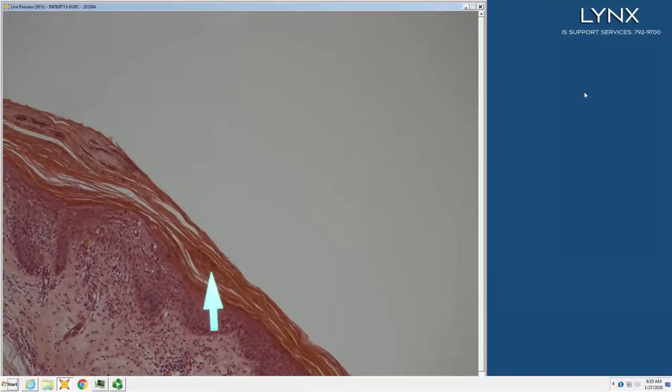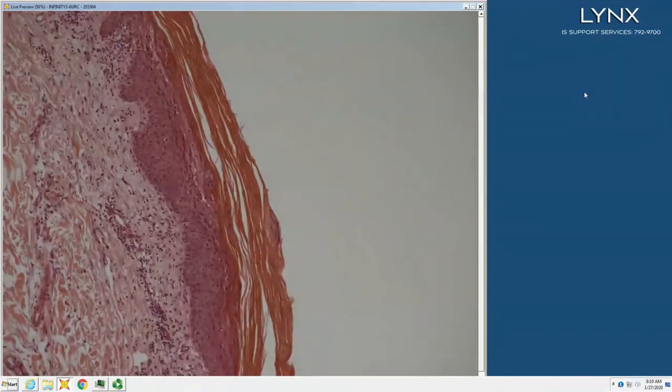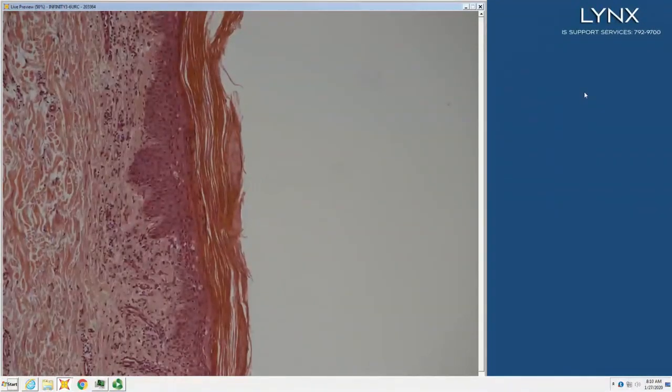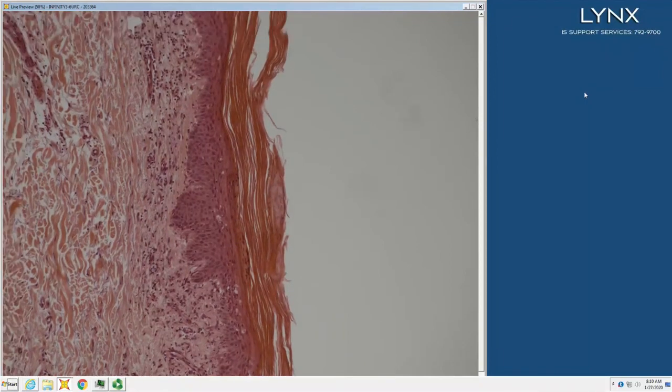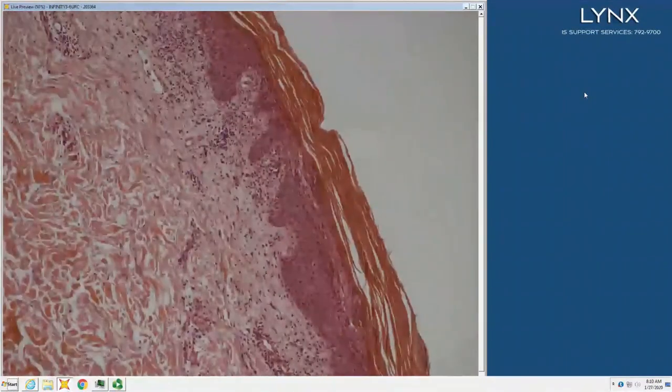So mixed horn, there are neutrophils in the horn, right? Does it look like a psoriasiform epidermis though? No, it doesn't. It really doesn't. So there are neutrophils in the horn, no psoriasiform epidermis. It could definitely be tinea. So it could be tinea. I see both spongiosis and interface. Could be viral, drug, viral. What's the other one that goes in? Is that syphilis, especially with neutrophils in the horn?